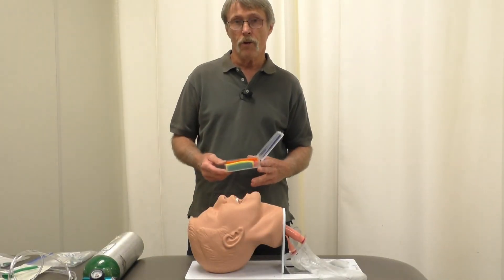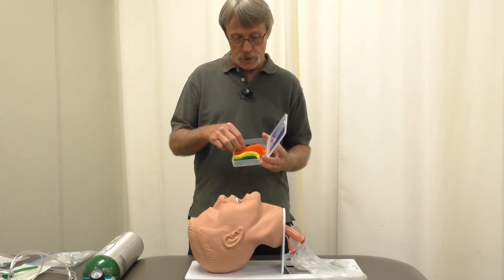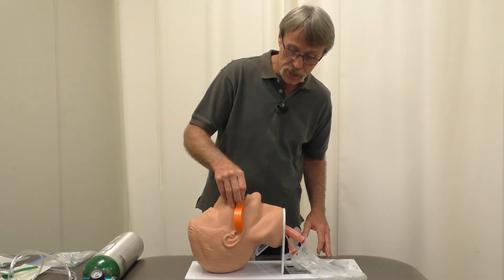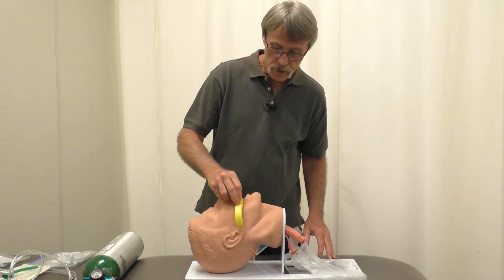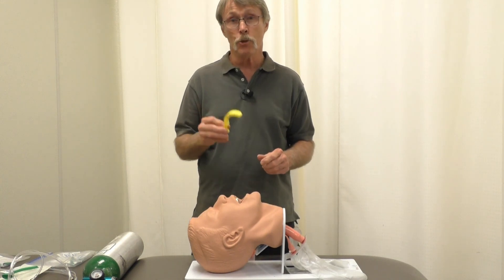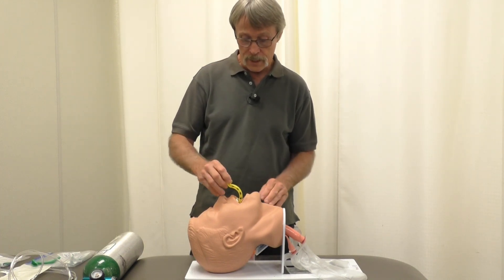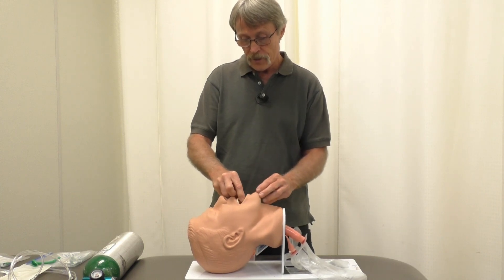Next, I'd like to demonstrate the oral pharyngeal airway. This adjunct gets inserted into the mouth and comes in different sizes. First, measure to confirm the correct size — hook it to the side of the mouth and reach down to the tip of the ear. If it's too long, try a smaller size until it fits correctly. Remember, if the patient has a gag reflex you cannot use this — go back to the nasopharyngeal airway, also called a nose trumpet. To insert it, scrape the roof of the mouth and as you insert it, twist it 180 degrees, which lifts the tongue off the back of the throat.